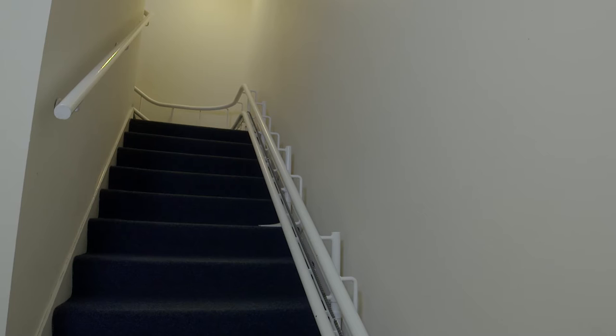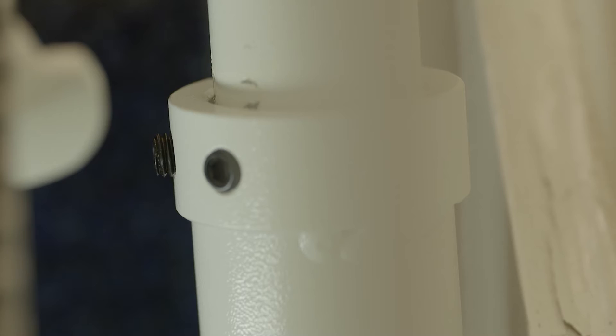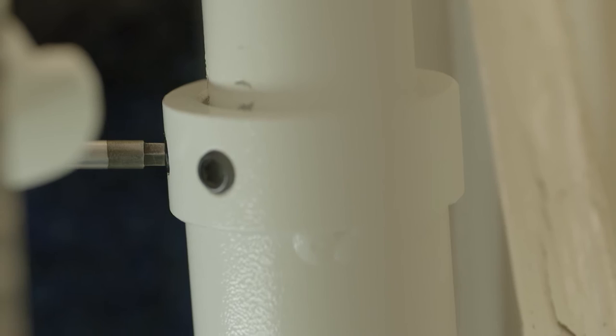When you are happy that the stairlift is in the correct position, individually loosen the grub screws on each of the base collars and secure each leg base to the staircase using the preferred fixing method. Failure to loosen the grub screws when fixing may cause the rail to move. Tighten the grub screws back up and repeat on each leg plate, ensuring the rail is still level.